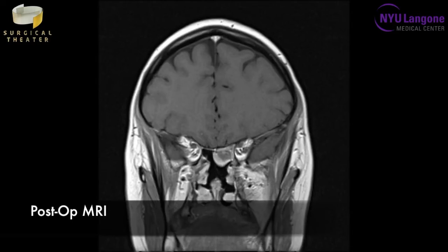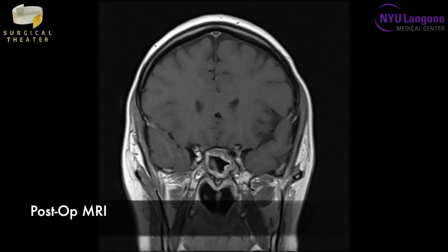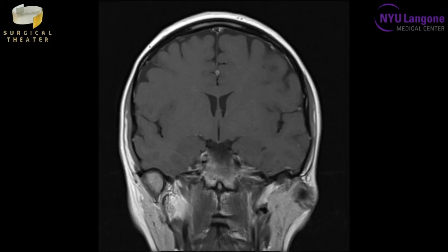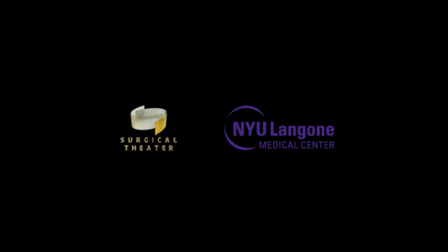And as you can see on the MRI after surgery, the lesion is removed and the patient felt much better. Her headaches went away and her endocrine profile remained essentially normal. So this was a great case illustrating the use of endosnap in endoscopic transnasal surgery for a pituitary tumor.